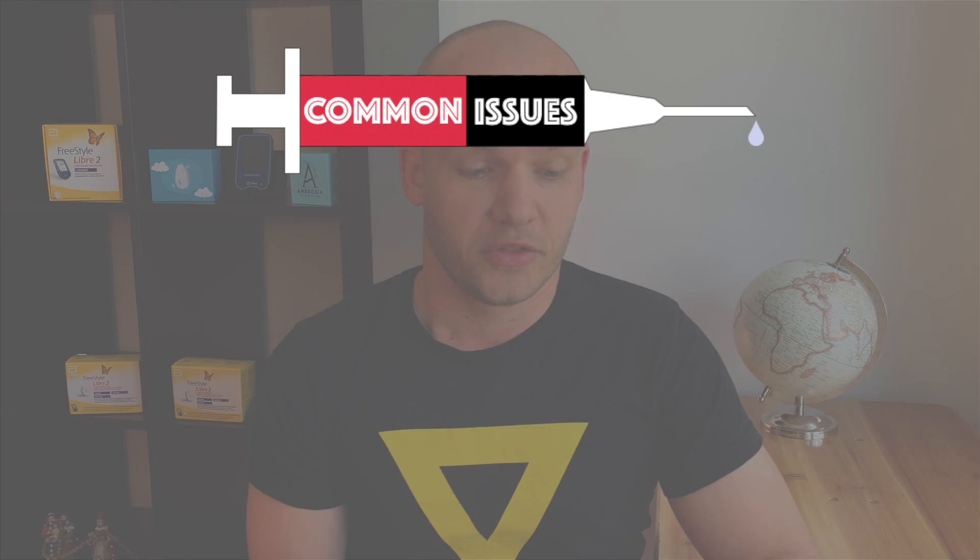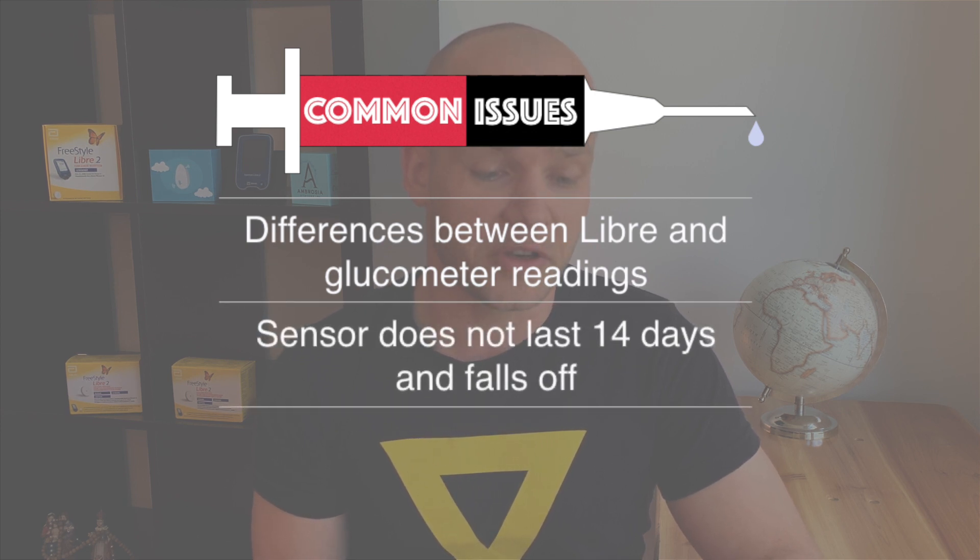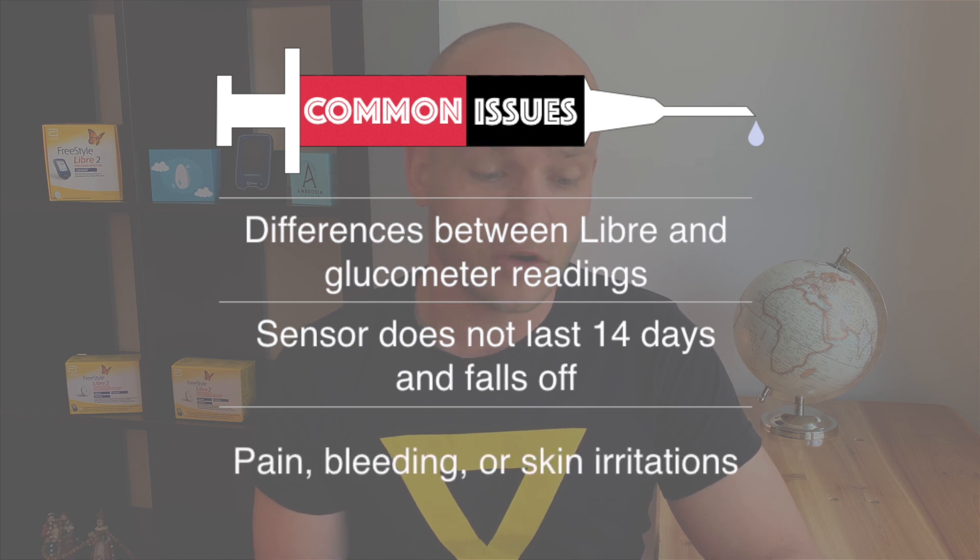Freestyle Libre is a great tool for diabetes management when used sensibly. Unfortunately, a lot of people don't fully understand how the system is meant to work and complain about a number of things: the sensor doesn't give accurate readings because my Libre says 8 and my glucometer says 11, or the sensor doesn't last 14 days and falls off way too early, or the sensor causes pain, bleeding and irritates my skin. If you're complaining as well, I fully understand your frustration.